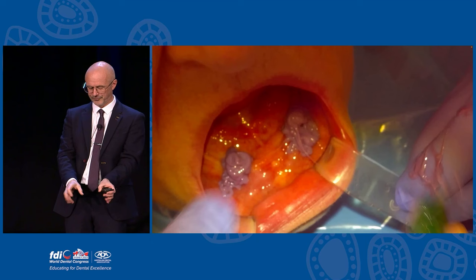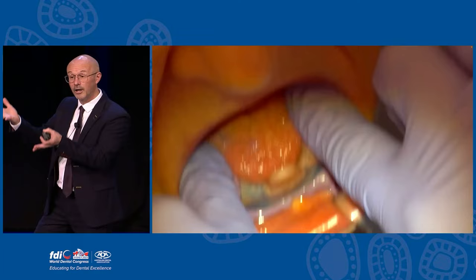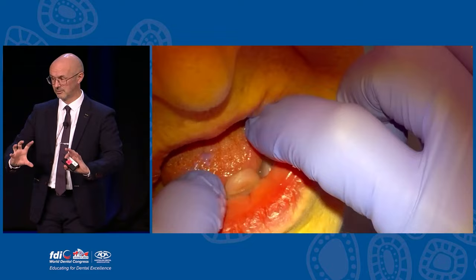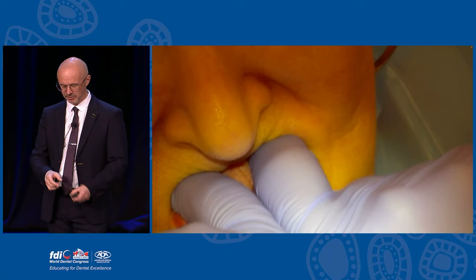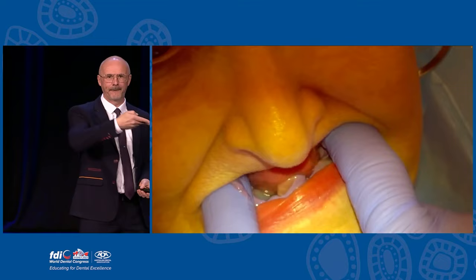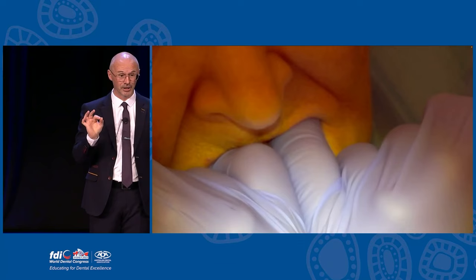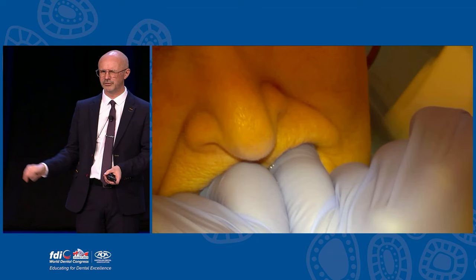I squirt some Imprigum around those impression pickups first, then rotate the tray in and position it. She lifts the tongue, relaxes, and it goes under and down. Five movements - EU first - these are the Arbe movements. For the inside: lick the lip windscreen wiper, push against the struts, squirt water in, powerful swallow. All of that periphery is beautifully moulded. The impression is just like a complete denture impression - really nice shape to it.